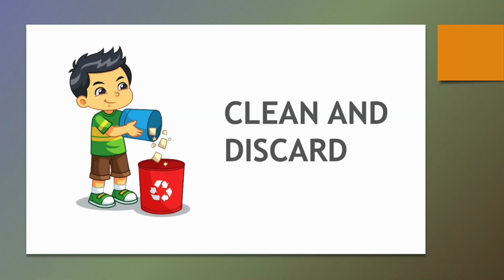Once done, discard your urine into the sluice room. Make sure that you wash all the equipment that you are using with soapy water, and store appropriately, allowing other colleagues to come and do the same procedure. Remove your gloves and discard everything you've been using into the red plastic, in accordance with the waste segregation policy of your hospital.